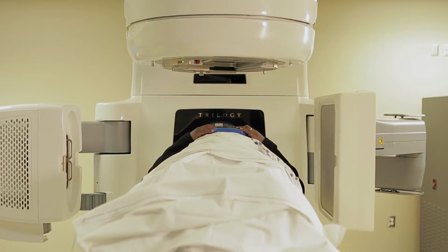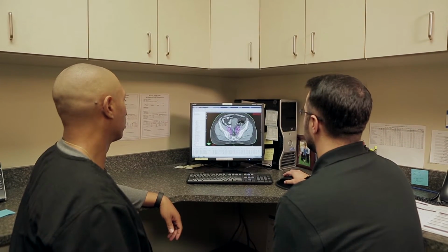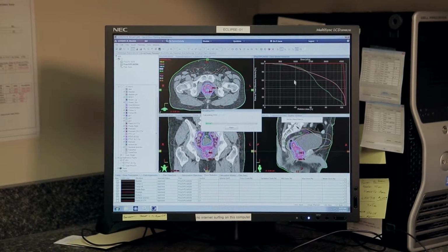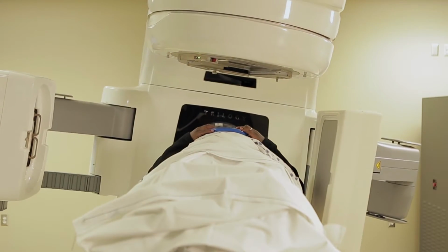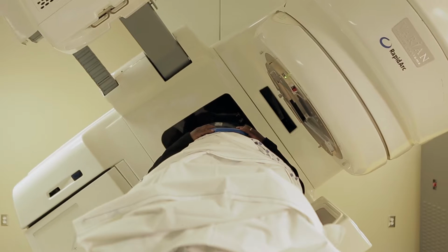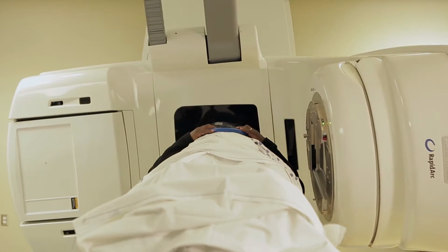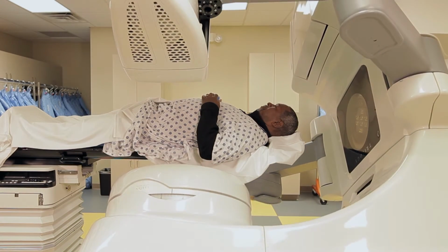During radiation treatment, the arms of the linear accelerator take daily images to ensure accuracy of the treatment. At least once per week, the therapist will check your bladder level and bowel content with a mini CT. The machine is delivering radiation to the target area for approximately 1 to 3 minutes. There is no need to shield or protect the body because the treatment is extremely precise. So remaining as motionless as possible is very important for accuracy of the radiation beam and for your safety. You can see you're approximately 5 feet into the air.